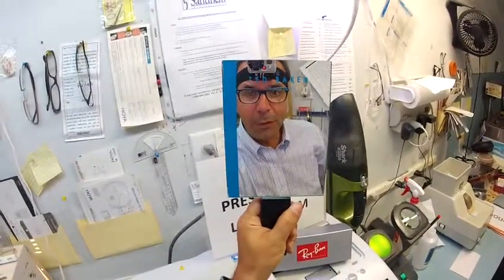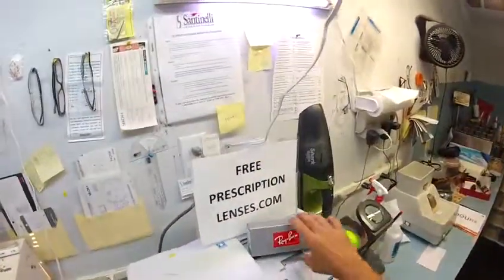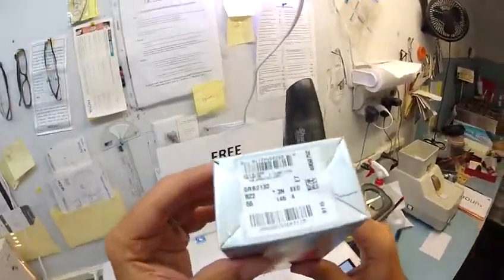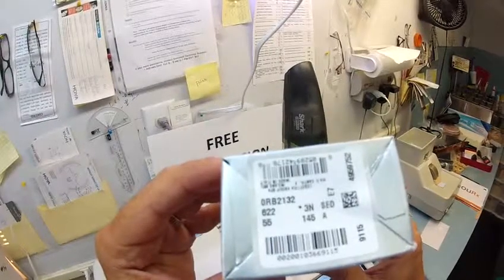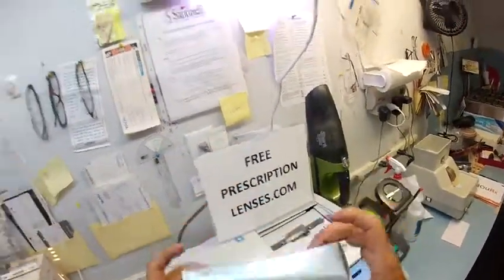Hey Victor in London, Matthew here with FreePrescriptionLenses.com and I'm going to show you how I cut transition lenses for your Ray-Ban 2132 New Wayfarer in color 6T2, which is the matte black rubber in the 55 eye size.